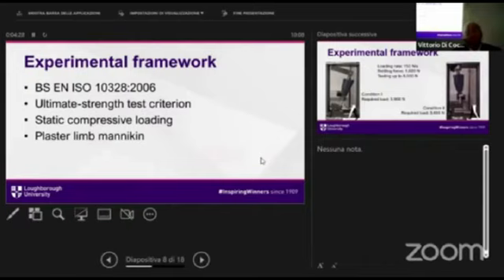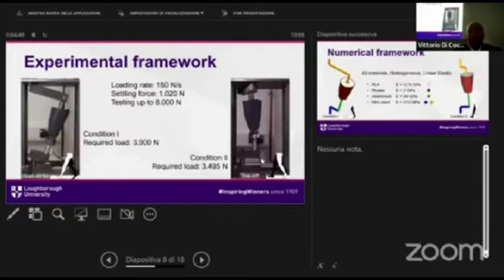The interesting point here is that though we have the standard, which is demonstrated here, there is not much information about this. And as you can imagine, this is not a material, this is a product. So that's why the type of loading and conditions is very straightforward. They are prescribed and related to the different stages of the gait. So this caused us to design a special test rig, because clearly when we are moving, depending on the gait, there is a change in the direction of the load, which should be reproduced in the testing device.